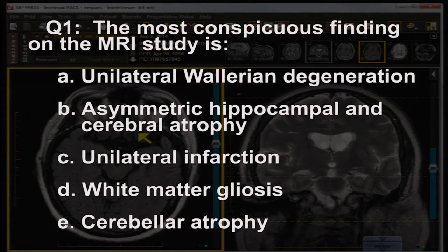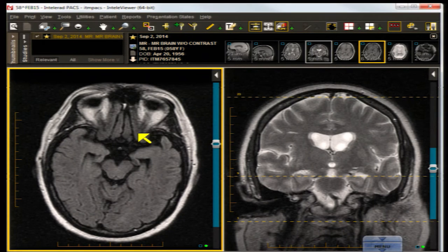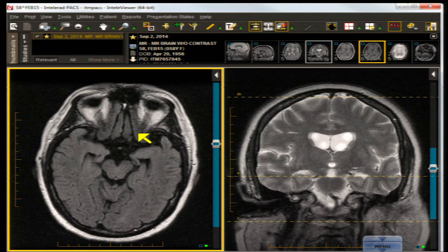The most conspicuous finding on the MR study — as we clued you in and pointed out — is asymmetric hippocampal and cerebral atrophy, left greater than right. We didn't find a unilateral infarction. We didn't find any large areas of confluent gliosis, although there were some scattered ones.